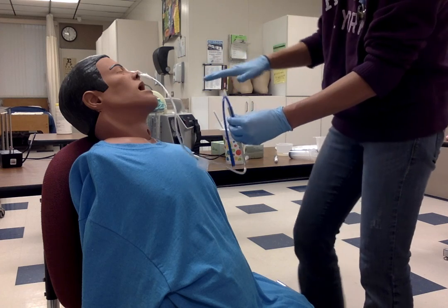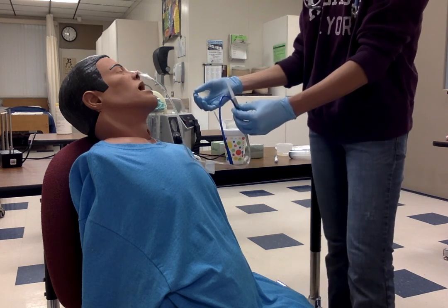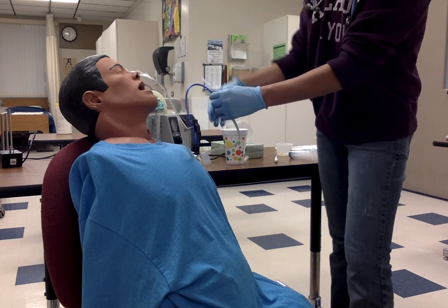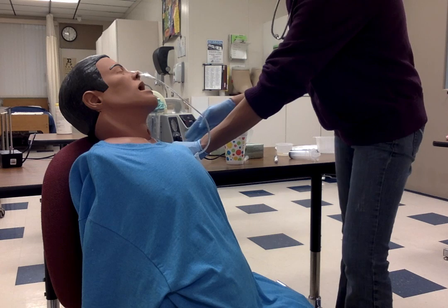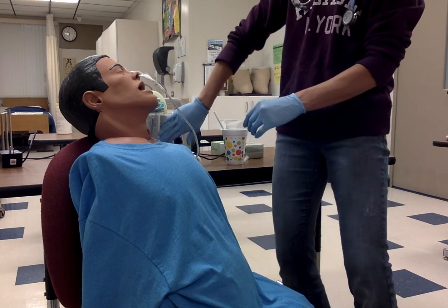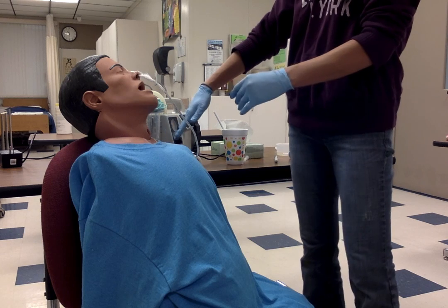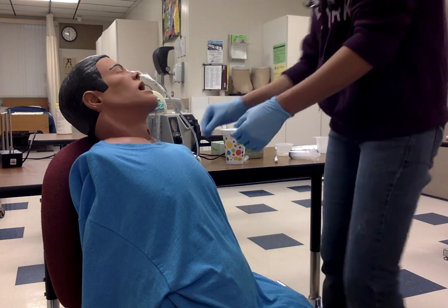And then at this point, you would hook it up to the suctioning. So I don't have any suction tubing that I could use, but it gets hooked up to the white tube here, and you would turn it on to like a low intermittent suction. So then that can fill up in here, and of course you're always going to want to document how much you have, and also the color and that type of information.